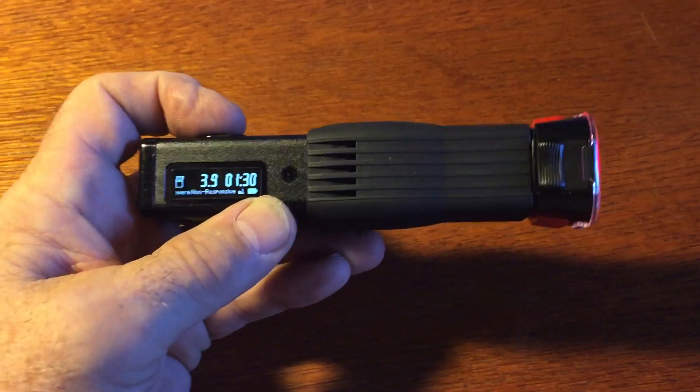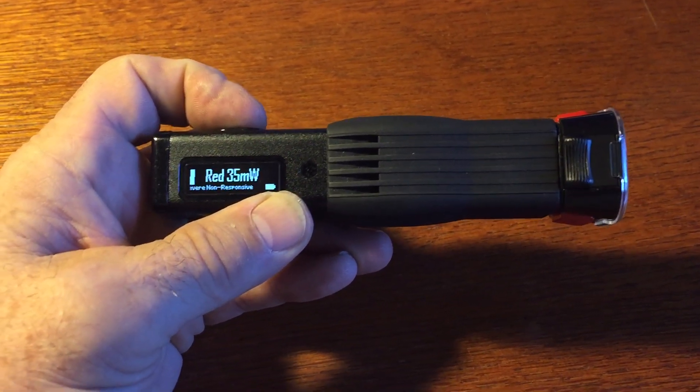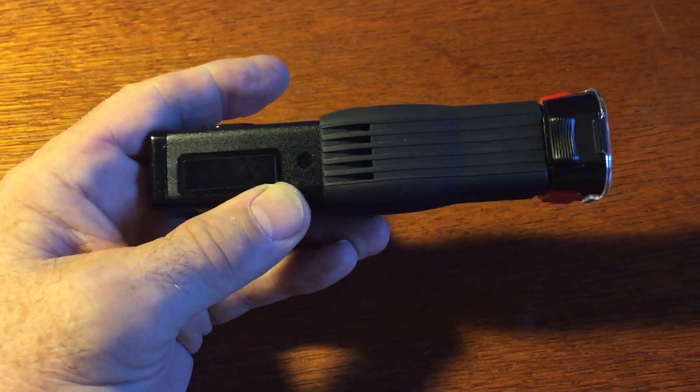To turn the instrument off, we hit the button again. To turn it completely off, we hold the button down until it does this. And now it's off.